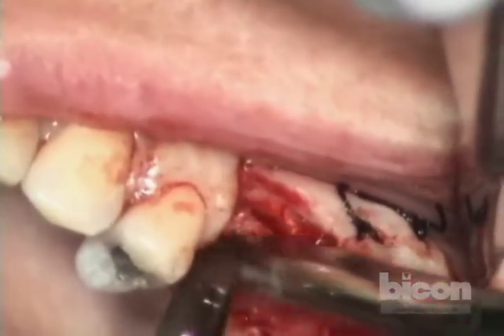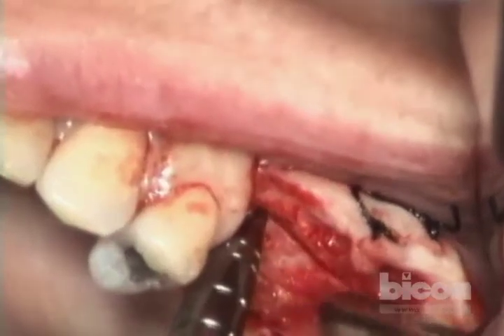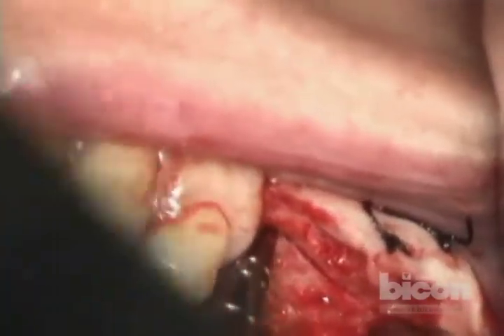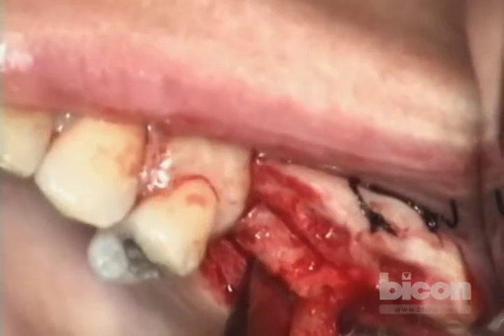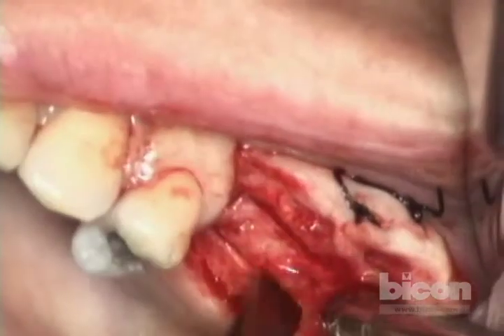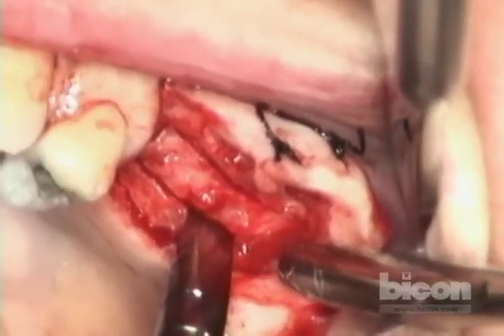I just want to make sure these cuts are complete. You can feel it, really. Always err on the side of shallower, because the idea is the bone, when scored, will fracture in there. You don't need to cut it all the way because you risk cutting the membrane.